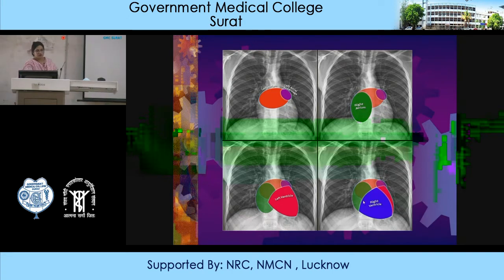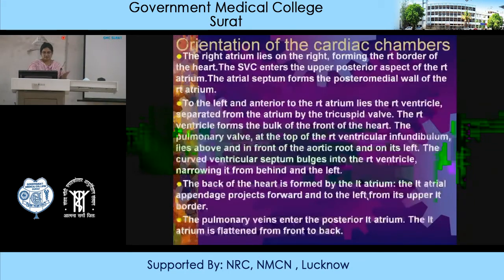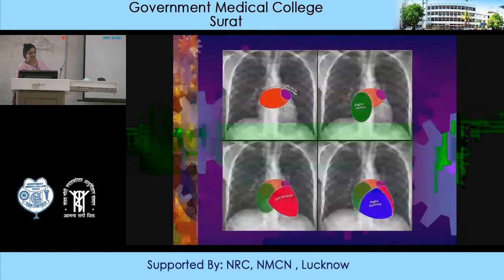Coming to the back of the heart, which is formed by the left atrium: the left atrial appendage projects forward and to the left from its upper left border. The pulmonary veins enter the posterior left atrium. The left atrium is flattened from front to back. This is the left atrium situated on the back side, anterior to the spine, and this is the left atrial appendage which projects onto the left side.